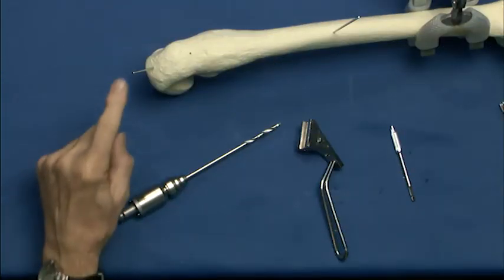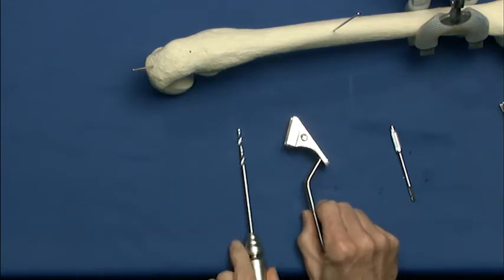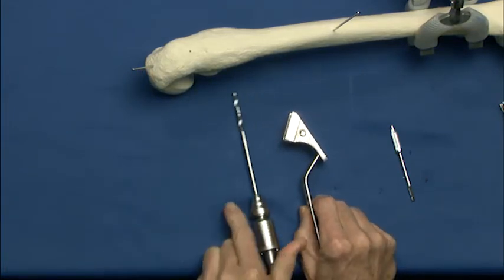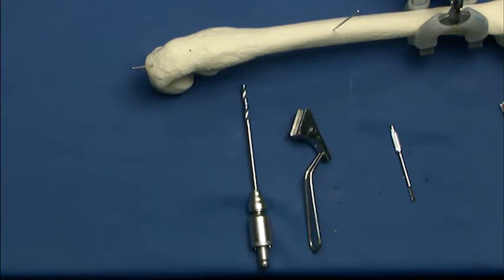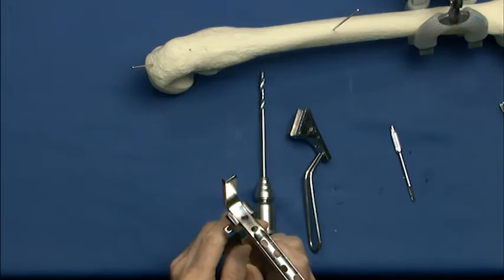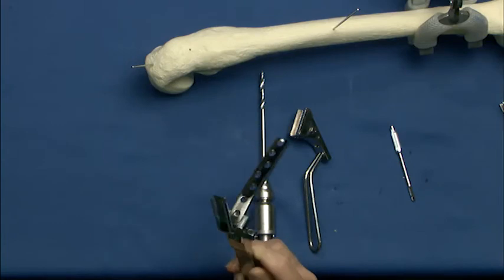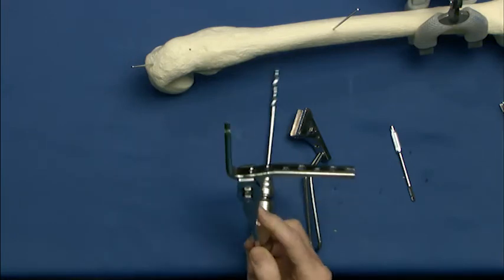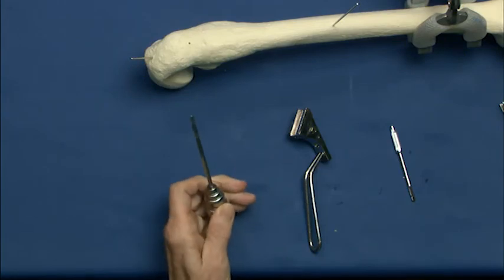In a normal situation with a cannulated seating chisel, you would never use the sequence which I'm going to show you with these drill bits, because you want as much cortex as possible intact around the flutes of this blade. The beauty of the blade plate is it removes no bone and it impacts bone as the blade is inserted. So this is the original instrumentation the way it was designed to be made.